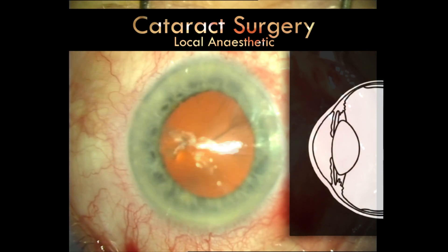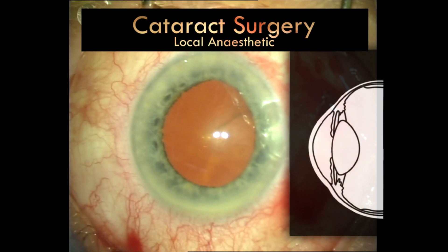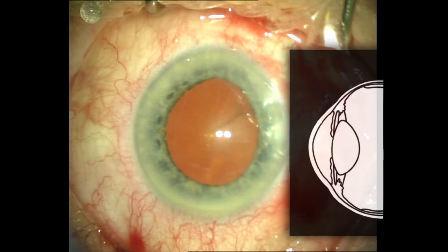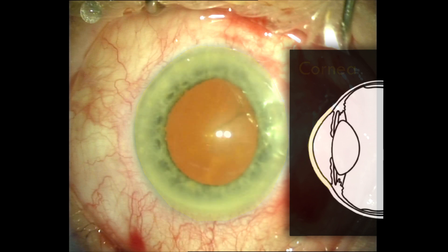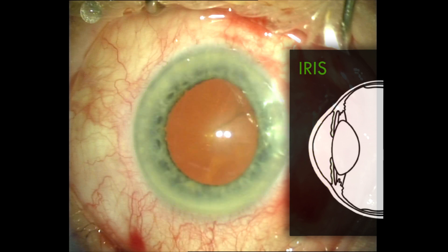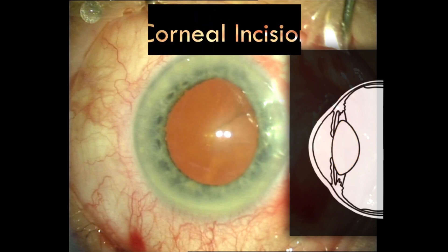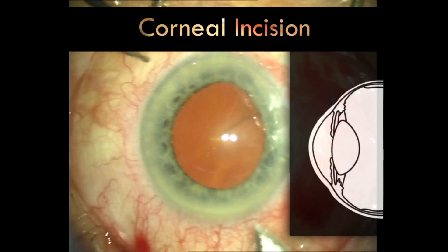For this case I've opted for sub-Tenon's local anaesthetic, and I've cleaned and prepared the patient with a drape. We're able to identify the main structures: the cornea, iris, and the lens. Just to orientate you, the patient is lying supine and I'm looking down a microscope at the top of the patient's head.